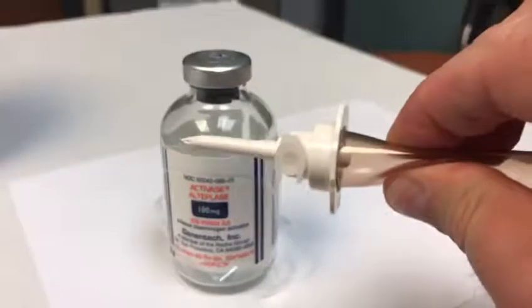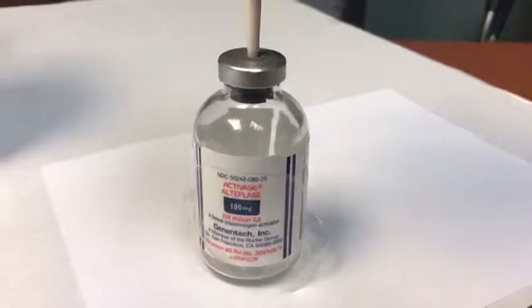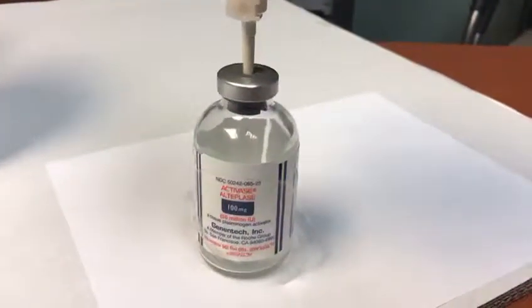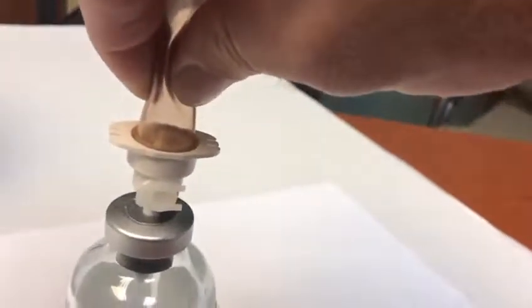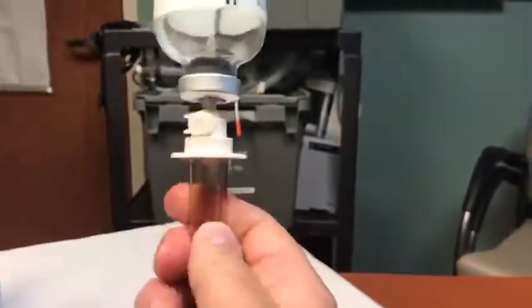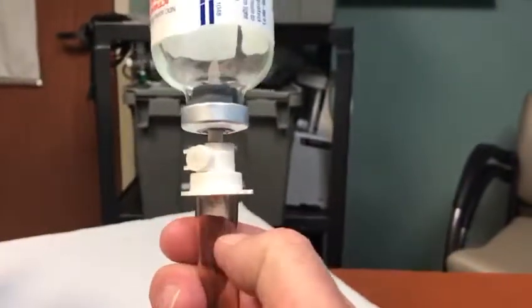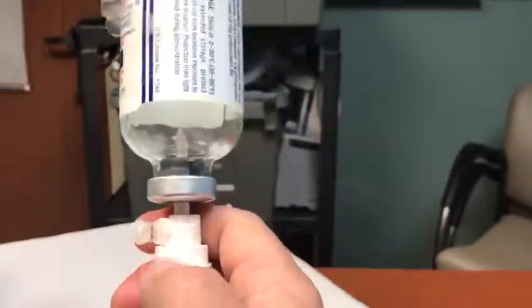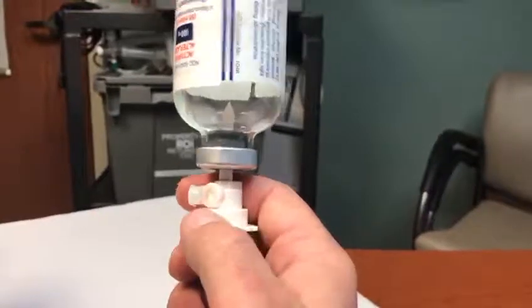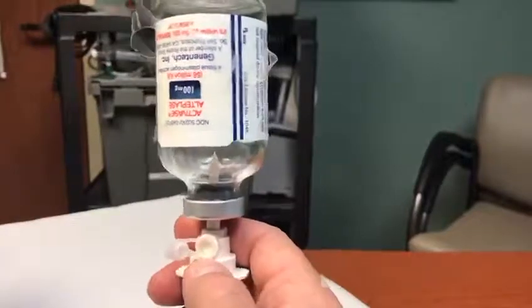So we're going to depress the chamber here, and then we're going to go straight into our medication vial. Notice I've got the medication vial on a very firm surface. I go straight in at 90 degrees. Once I get it spiked, while I'm still pressing the chamber, I'm going to right it up, and I'm going to let this chamber fill to about 2/3. Notice I do not have the vent cap open yet. Once it fills up to about 2/3, then I can go ahead and pop the vent and allow air to enter. We don't want to pop that vent too prematurely because then it may get moistened and not be able to pull air in, and then you'll get all kinds of alarms on your pump.